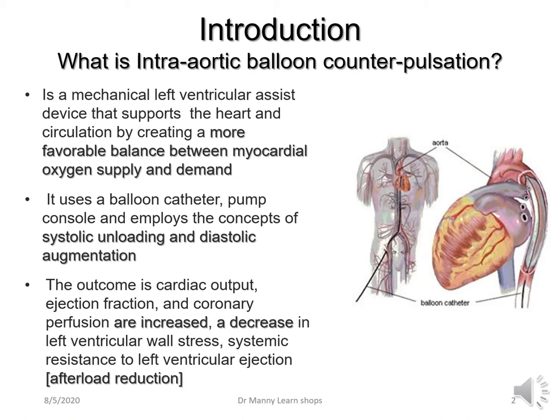It uses a balloon catheter, a pump console, and employs the concepts of systolic unloading, afterload reduction, decreased workload, and diastolic augmentation, increasing coronary perfusion basically. The outcome therefore is an increased cardiac output, a better ejection fraction and stroke volume, improved coronary perfusion, and a decrease in left ventricular stress, workload, and systemic vascular resistance. As I said, afterload is reduced.